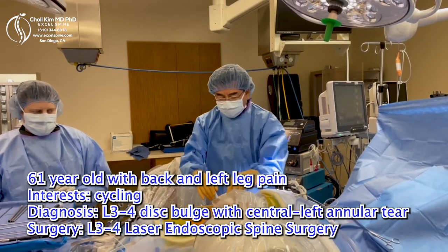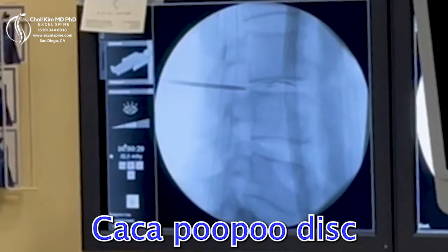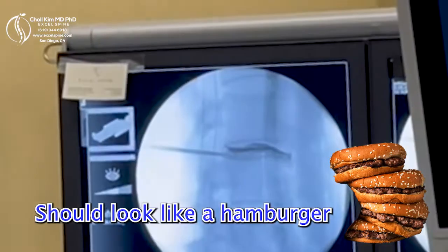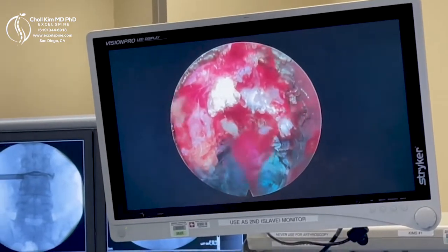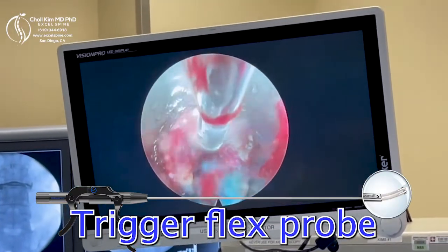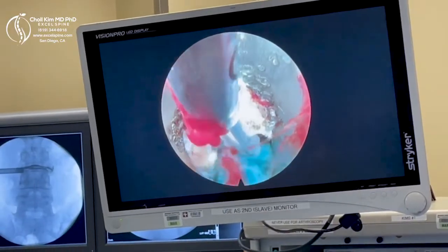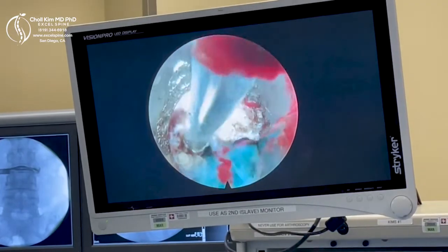Burst, spike train — whatever. Shot and save. That's a caca-poopoo disc for sure. Shot and save. You can see the outline of the annulus already, and you can see how degenerated this disc is. It should look like a hamburger with two buns and a patty — it looks like a snake. This is the absolute first look. I just put in the scope and immediately we see the bad stuff — that's the blue. This is the trigger flex probe: it's a radiofrequency electrical probe, an ablator, a coagulator, and a feeler. It has lots of tactile feel, it's curved so you can get around corners. I feel the bone edge right there. The disc is right here, and I bet when we go more inside we're gonna find the empty tent sign where your annular tear is.